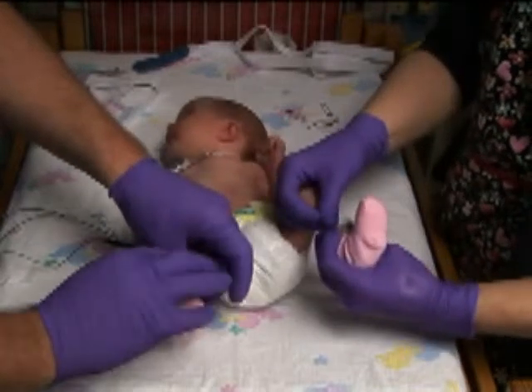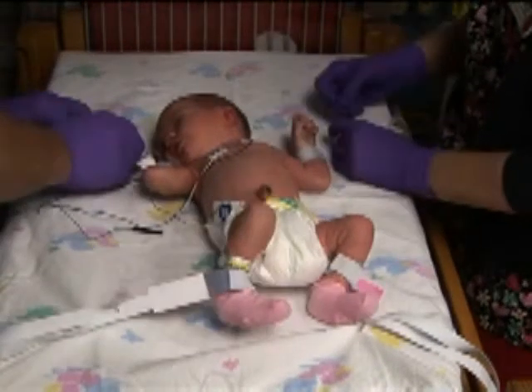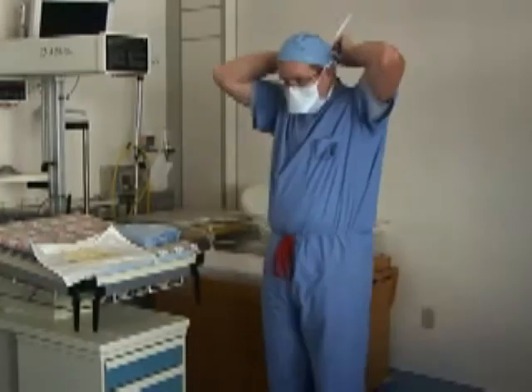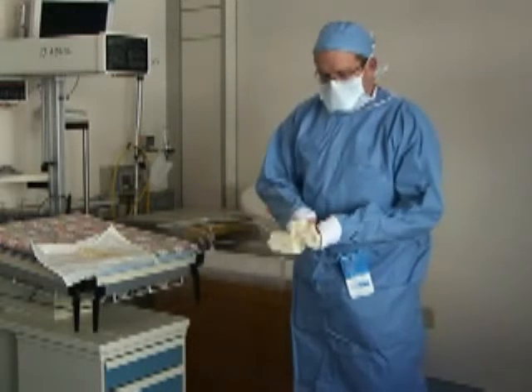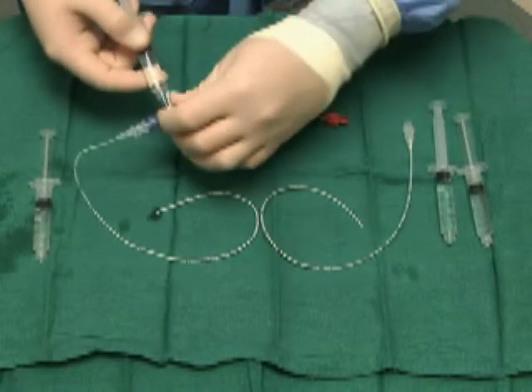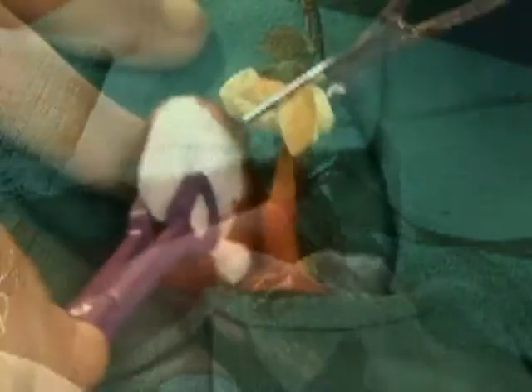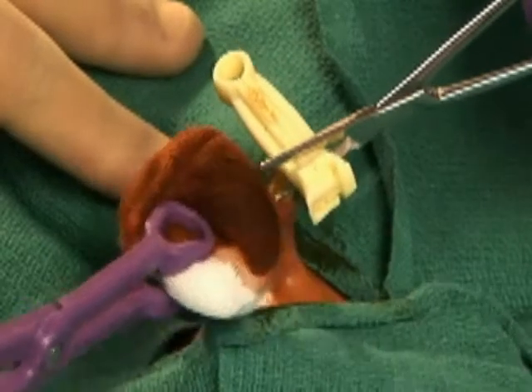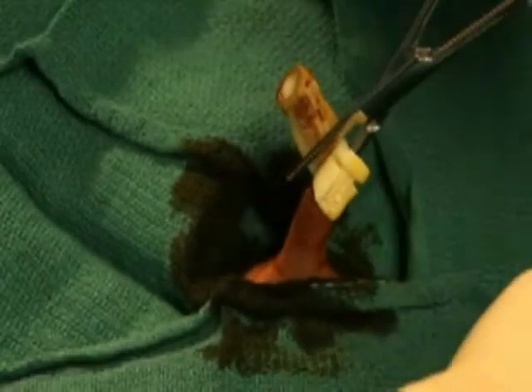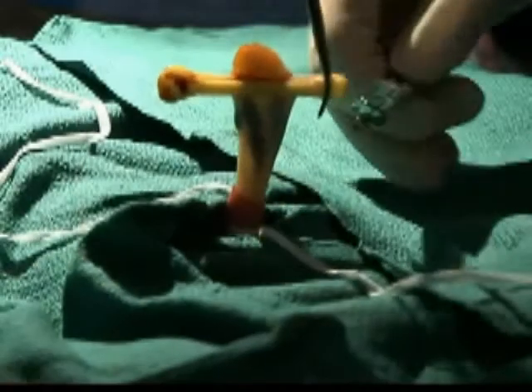The infant should be placed in the supine position on a radiant warmer, and the arms and legs secured to avoid movement that might contaminate the sterile field. Sedation is generally not needed because the skin is typically not cut or punctured with a needle. Make the necessary measurements to estimate the depth of catheter insertion. After you are fully scrubbed and garbed, attach a stopcock to the hub of each catheter and fill the system with flushing solution, ensuring each stopcock is in the off position. Ask an assistant to grasp the cord by the cord clamp and apply traction vertically. Apply antiseptic solution to the cord and surrounding skin, then apply sterile towels or surgical drape so that the patient's face is visible. Wrap the cord tie around the base of the umbilicus and tie with a single knot, tight enough to prevent bleeding but loose enough to allow the catheters to pass through the vessels.